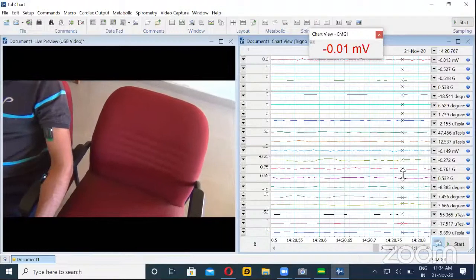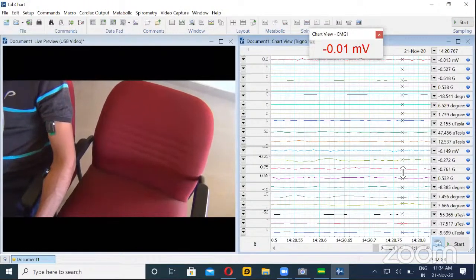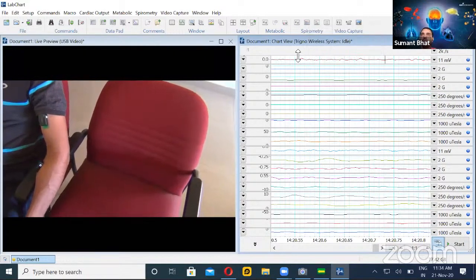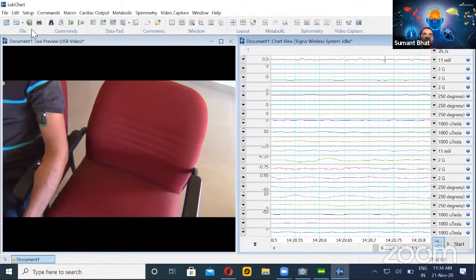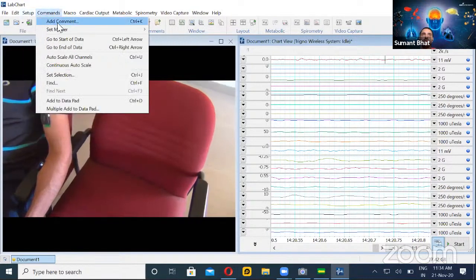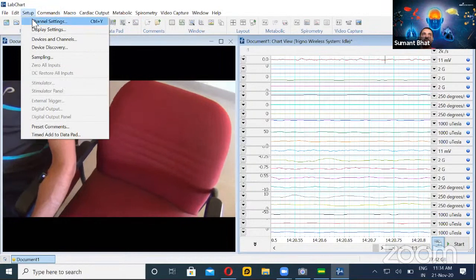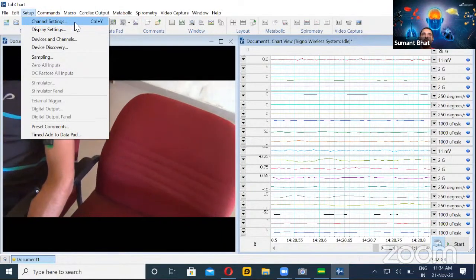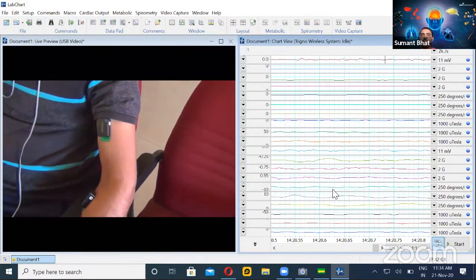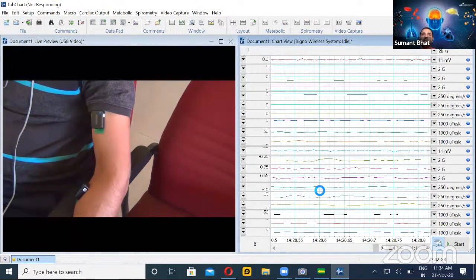You can also rename the channels — suppose you have five or six sensors and want to know which is which. You can click on Setup from the menu and go to channel settings, or use the shortcut key Control+W. A popup will allow you to rename the channel, increase or decrease the number of channels, or adjust settings for particular channels.